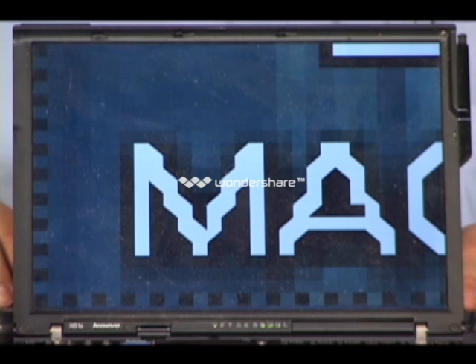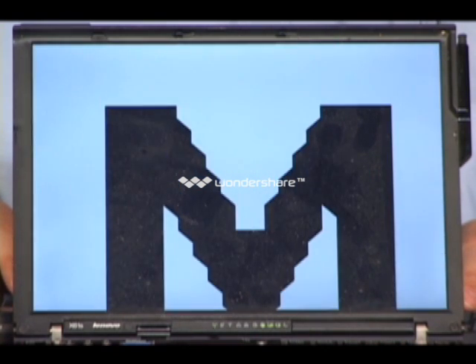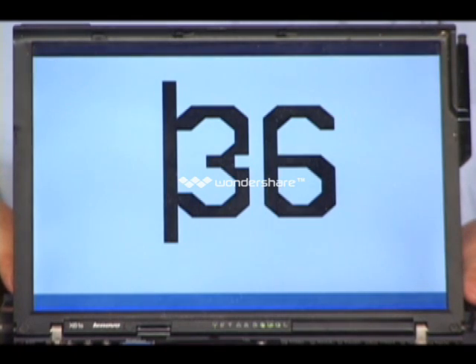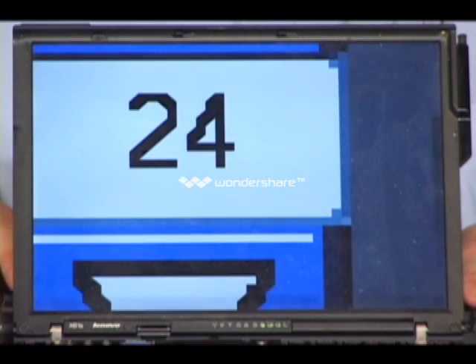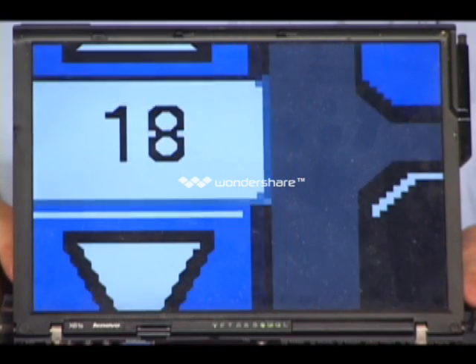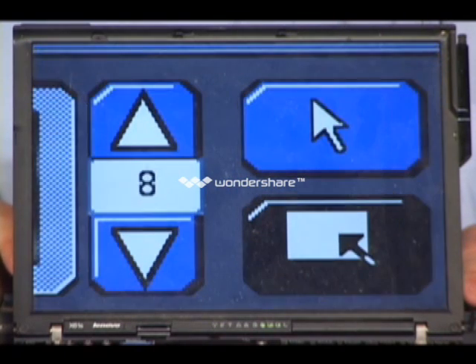Now, as I said earlier, if you have to magnify your screen to 36 times, you better look at some other way to access the computer. If you really can't read it at that size, let me go over here and bring it down again. If you really have to magnify it that large, you should probably look at another way to do this, because really, once you get on any computer screen, once you get past about 8, this is 8.